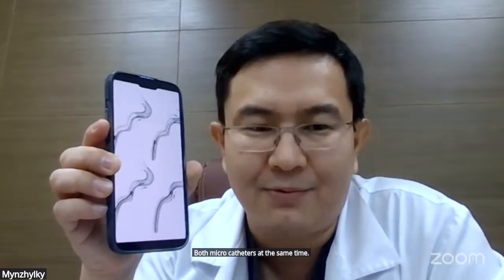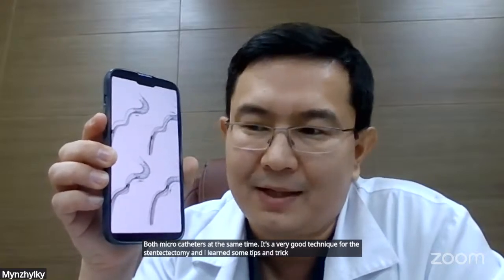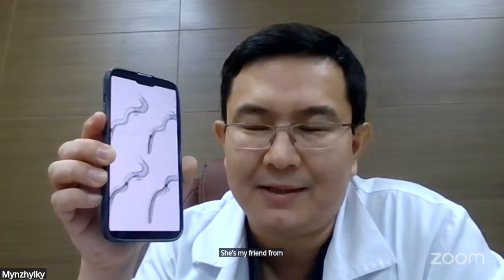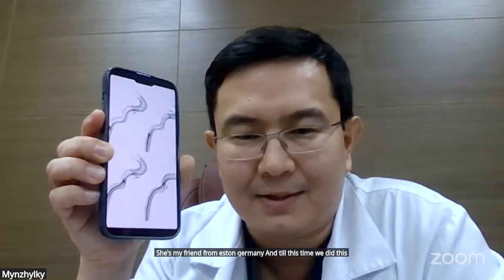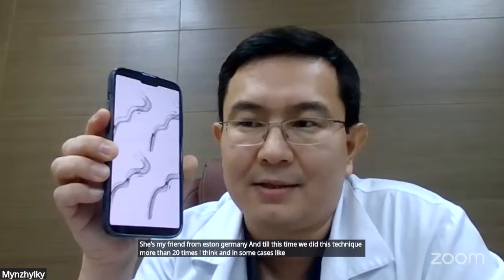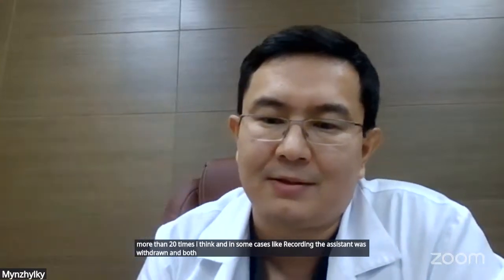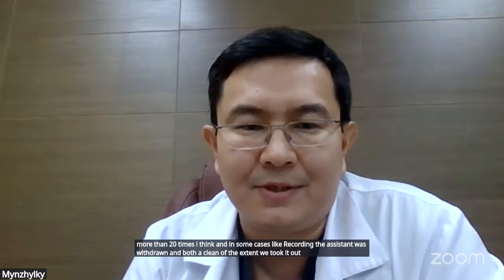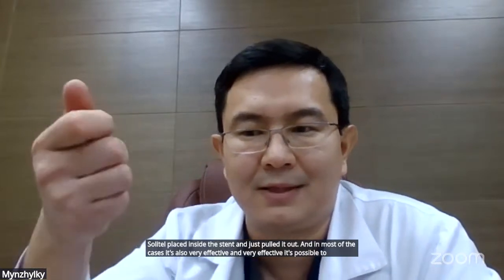It's a very good technique for the stentectomy, and I learned some tips and tricks from René Chapeau, my friend from Essen, Germany. Till this time, we did this technique more than 20 times, I think. In some cases, like a coronary stent was withdrawn and both Acclino Flex stent, we took it out. It was just Solitaire placed inside the stent and just pulled it out. In most of the cases, it's also very effective, and it's possible to take the thrombus with the stent inside.